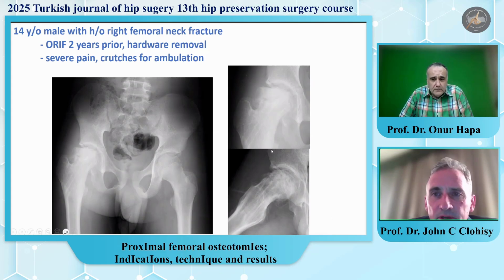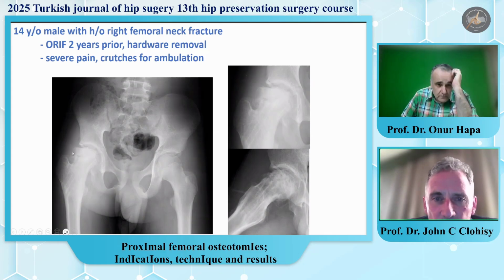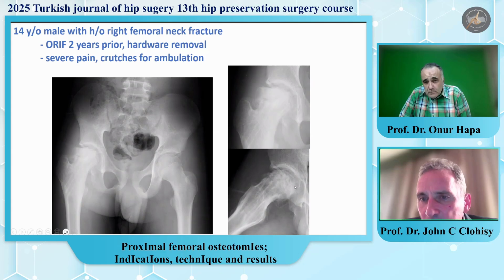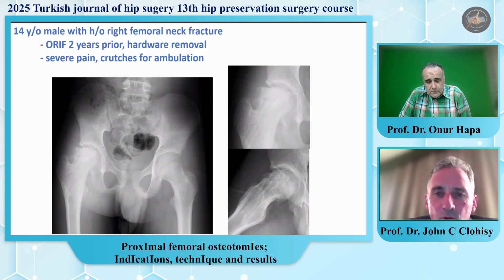So, a pretty diseased hip. We're concerned about the collapse of the femoral head. We're concerned about the extrusion of the femoral head, as that can create impingement. When we look at the lateral view, there's a hint that maybe there's some healthier femoral head, posterior and medial, that could perhaps be repositioned to make this a more functional hip.